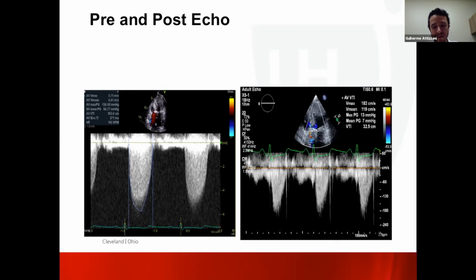I think we're still in the infancy of a complete understanding of bicuspid intervention. Some anecdotal cases that we have seen with some bicuspids, due to this incomplete expansion of the valve, sometimes there's actually some thrombus in the sinuses because of the incomplete washout. Not inside, not a halt, but outside, actually, that we have noticed that.